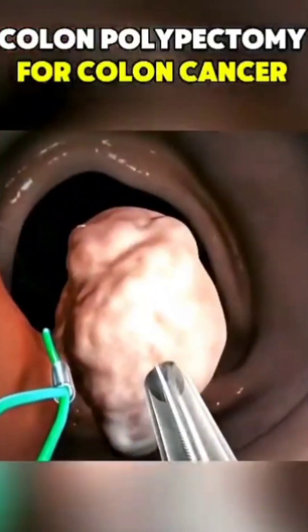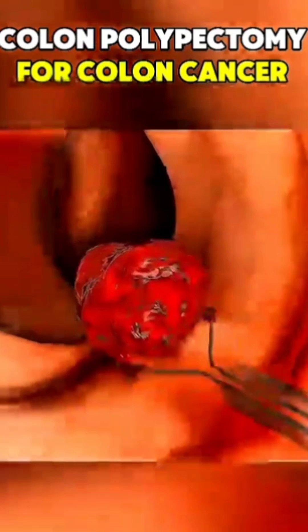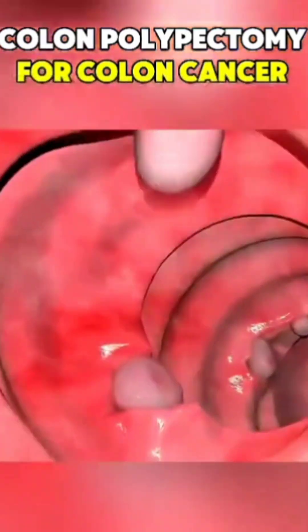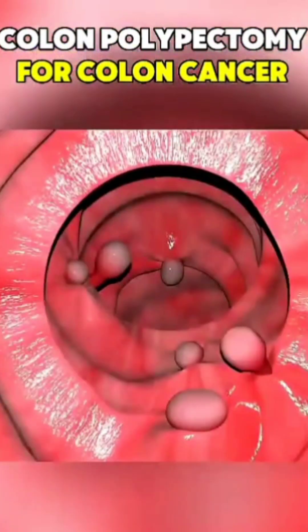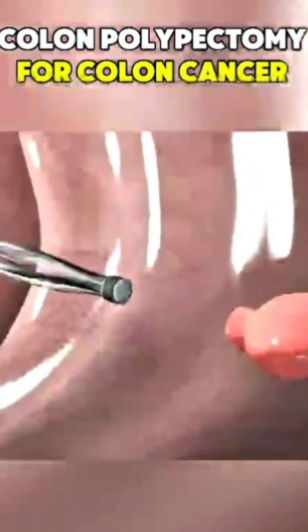What if removing a potential cancer took just a few minutes, with no surgery at all? That's exactly what happens during a colon polypectomy. Polyps are small growths inside the colon. Some are harmless, but others can turn into colon cancer over time. That's why doctors remove them early, often during a routine colonoscopy.